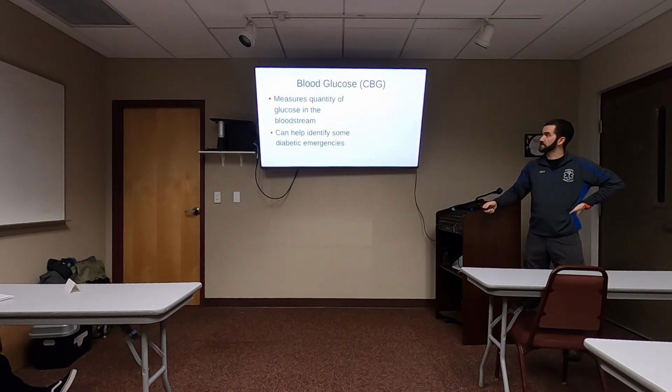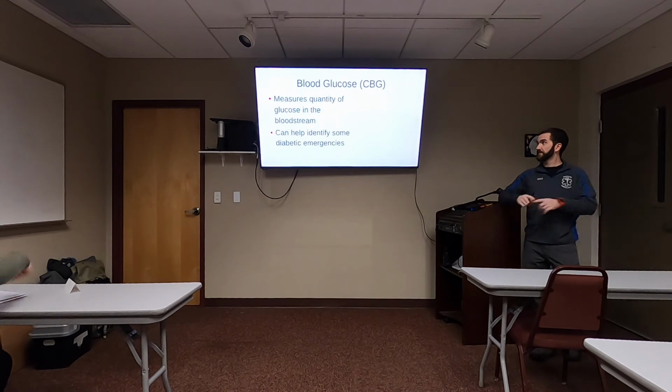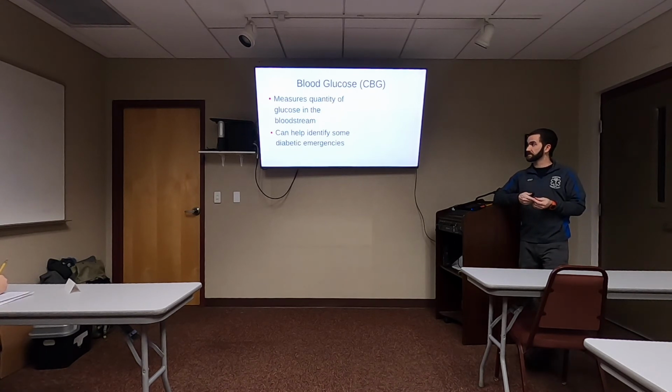Blood glucose. So we are allowed to prick people's fingers and read their glucose. It's not a bad thing to check for any unknown unconscious person.